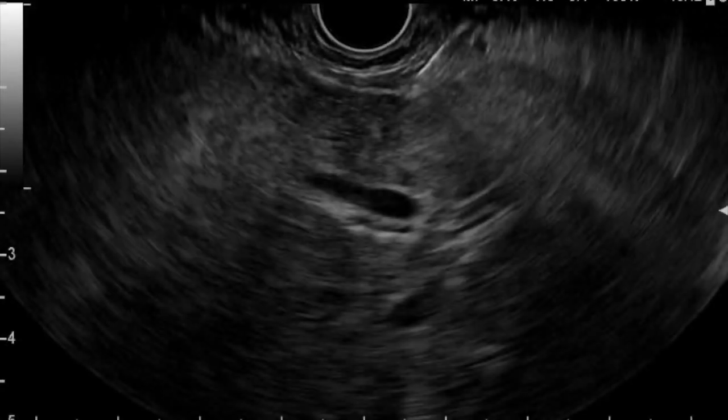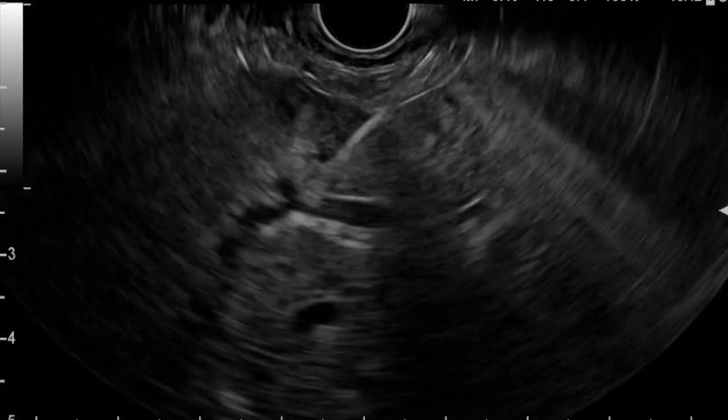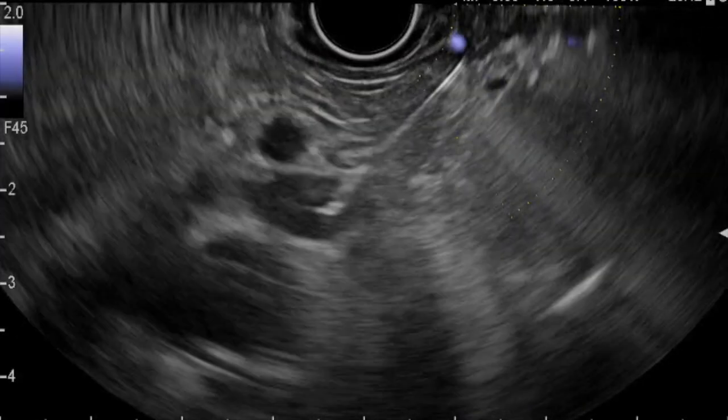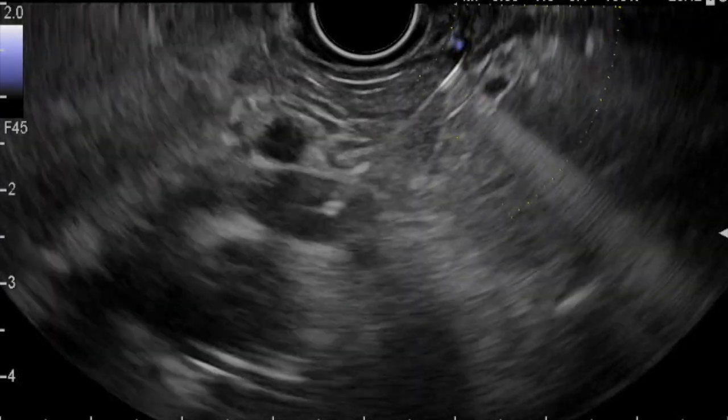It can be just as easy to puncture the left hepatic vein as seen here in a different case, although I share this to demonstrate that an increasingly fibrotic liver can be slightly tougher to access the vein. Then of course puncture the left portal vein branch or the main portal vein for a further 3 readings.